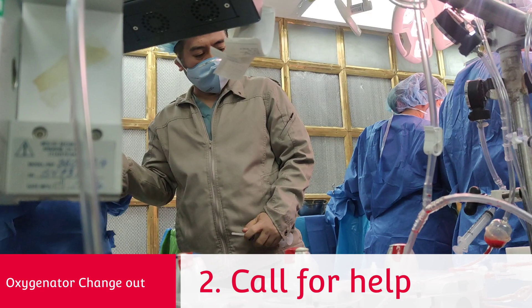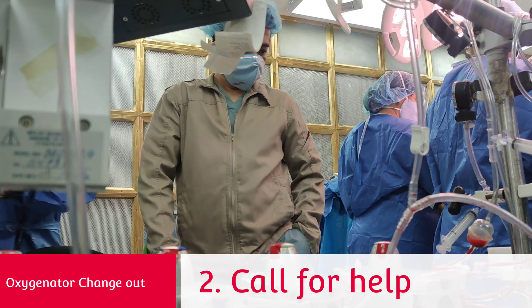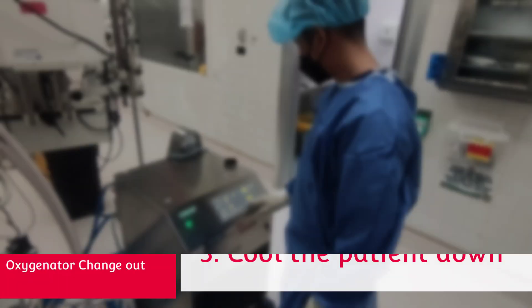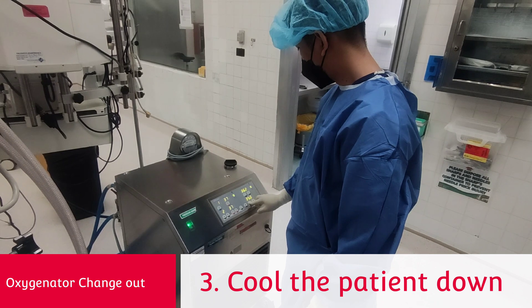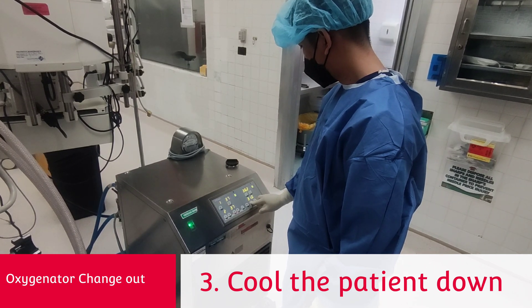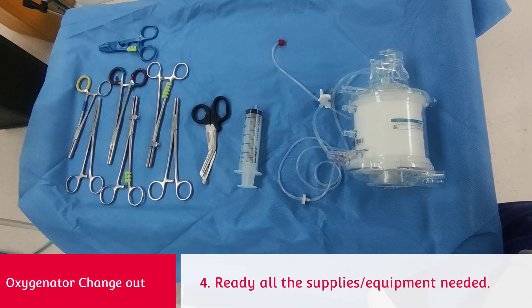Next, try to find some help — anyone will do, but another perfusionist would be great. Cool the patient down as fast and hard as possible. As soon as you have reached a decent temperature, stop the pump. After that, stop the heater cooler and remove the water exchanger hose. Get all your supplies ready.